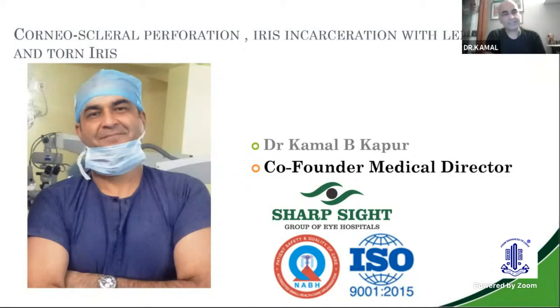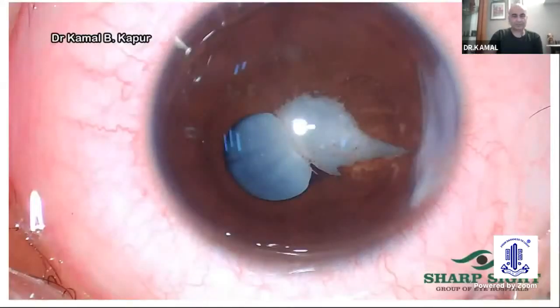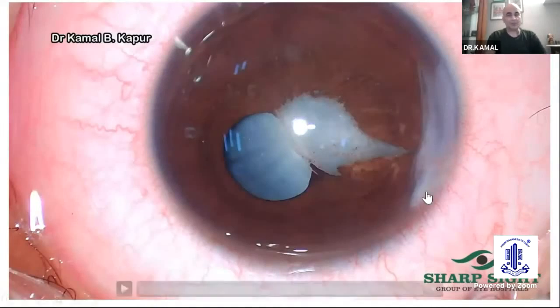I'll show you an interesting case. This is a case of corneascleral perforation with iris incarceration, lens rupture, and a torn iris. This is a 5-year-old girl. She came from outside Delhi, and this is a 4-day-old injury. So I'll go on with the video.